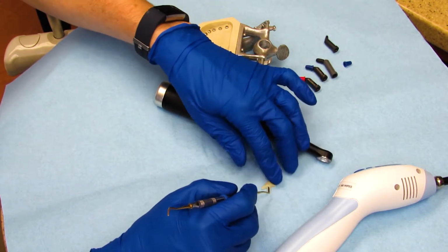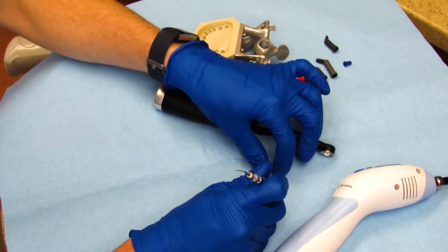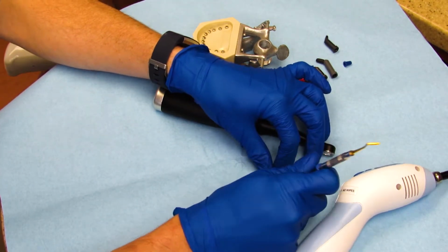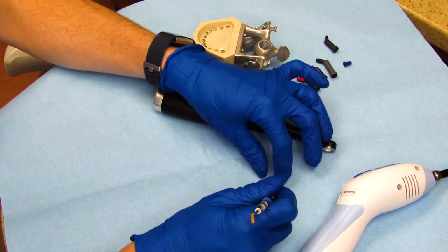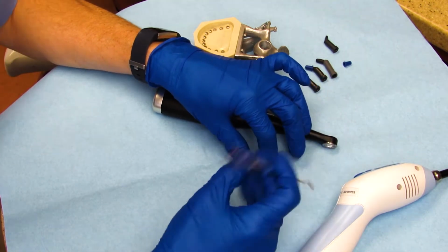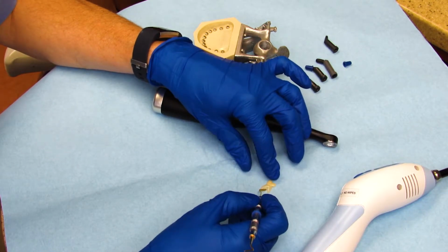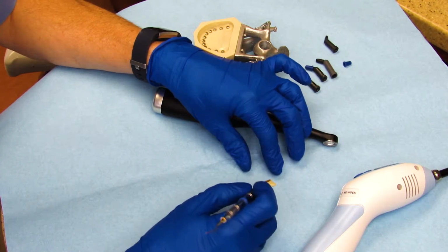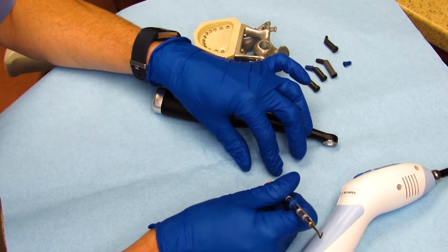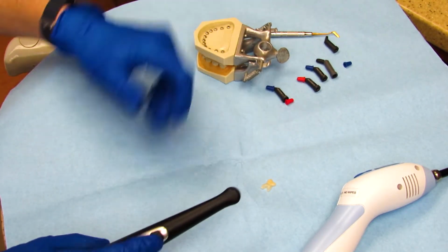So when I make a filling, I will sculpt the tooth, kind of like what I'm doing right here, and make it adapt to where the tooth is. Put a little bit of anatomy in this tooth to make it look a little bit more like a tooth. There you've got the roots of this tooth, and this would be a molar tooth, but that's what the tooth looks like. So what happens is, you saw I could sculpt and everything there.